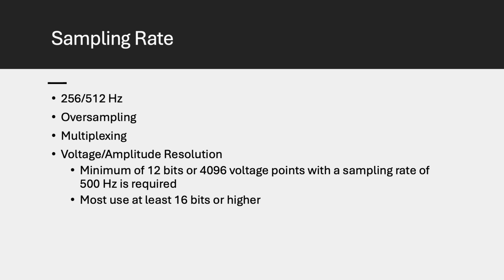The sampling rate of a modern analog to digital converter can actually exceed 32,000 samples, and by using the Nyquist sampling theory, this results in a reliable frequency spectrum of up to 16,000 hertz. The raw data stream can be filtered in software before secondary sampling, which we call decimation, which creates an output data stream typically at a sampling frequency of around 256 to 512 hertz. This technique is called oversampling and allows a high degree of flexibility in selecting output data rate and eliminates aliasing without the use of large and expensive electronic components for low frequency filtering.